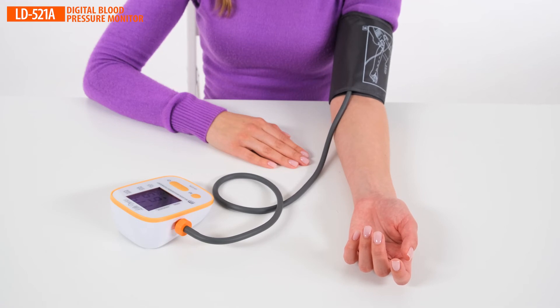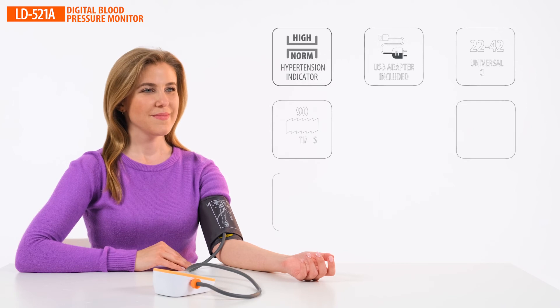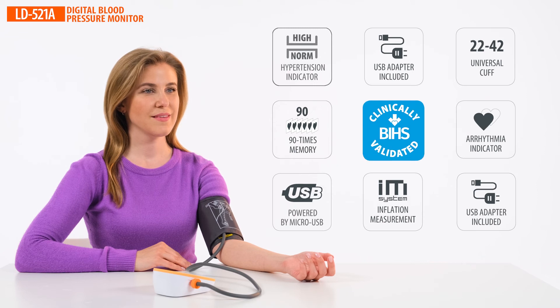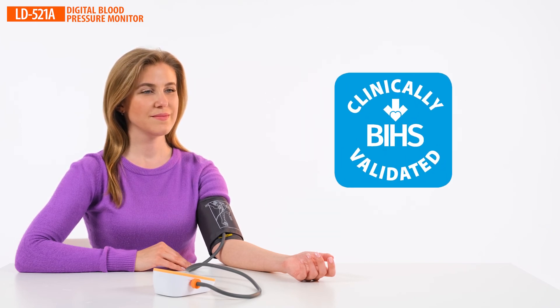LD blood pressure monitor advantages: high accuracy, measurement during cuff inflation, large easy-to-read screen, powered by any micro-USB power supply, and a safe certified adapter included. The blood pressure monitors are clinically tested and recommended for use by the British Hypertension Society.